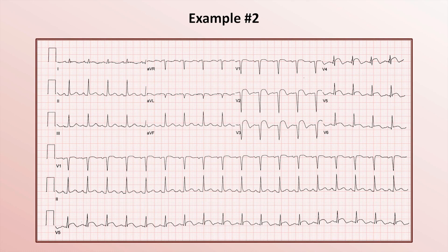Example 2. What's the rate? Using the 300 rule, there are slightly less than 3 big boxes between successive QRS complexes, which means the rate is slightly faster than 100.